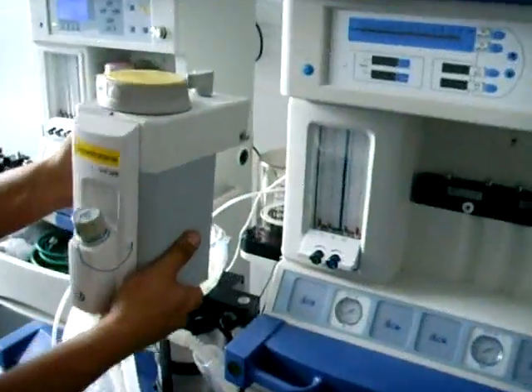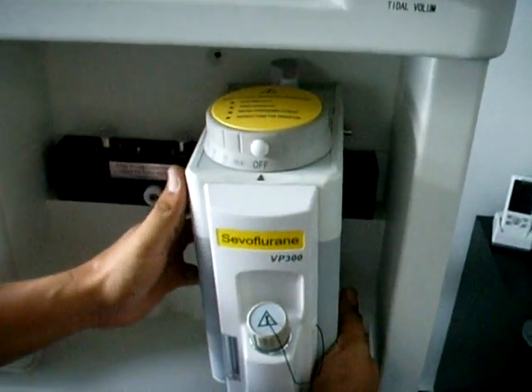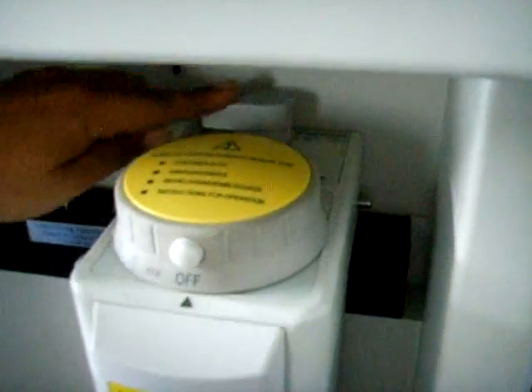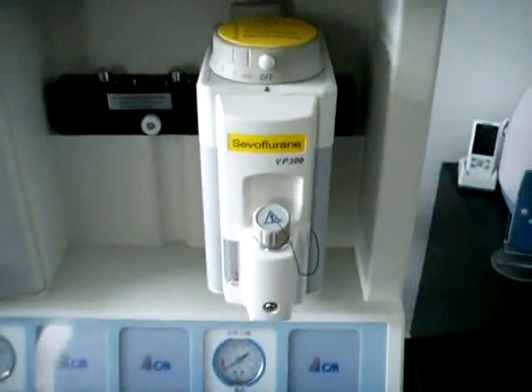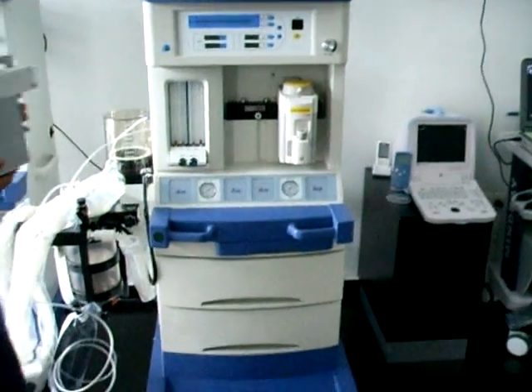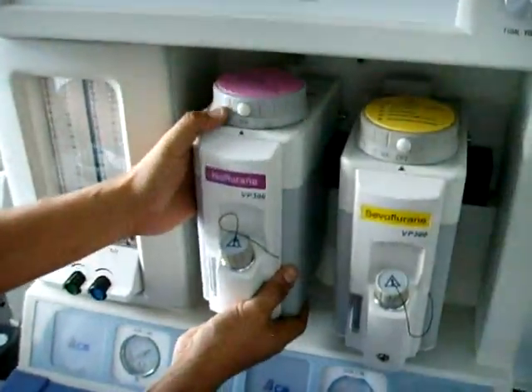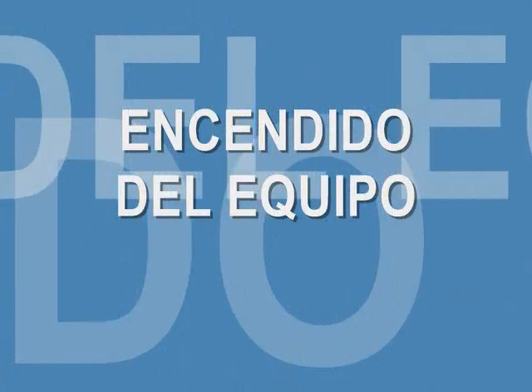Para finalizar la instalación procedemos a hacer el montaje de los vaporizadores. Para esto debemos introducirlo de manera vertical sobre el equipo y asegurarlo con la perilla en el fondo. De igual manera hacemos con el segundo vaporizador en la máquina de anestesia y lo aseguramos con la perilla del fondo.